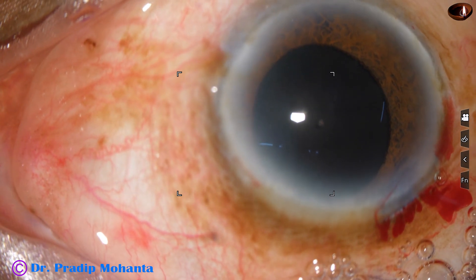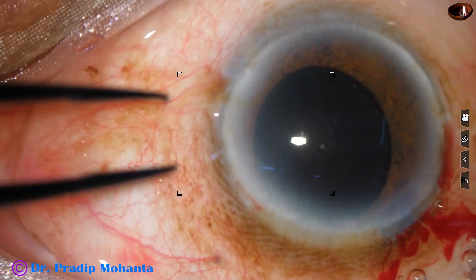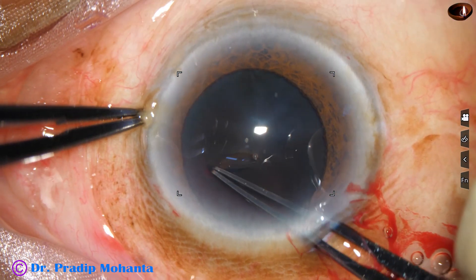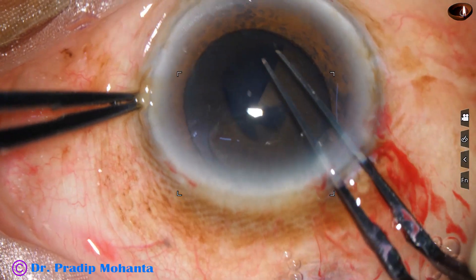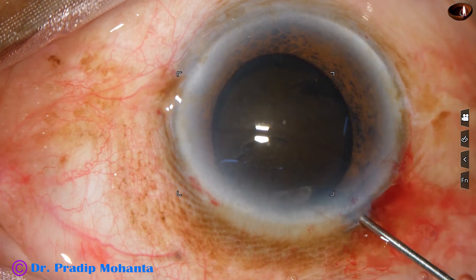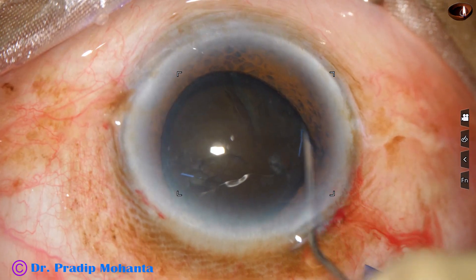And now capsulorrhexis is to be done. I take Utrata forceps, pierce the anterior capsule at the center, and raise a capsular tag. This capsular tag is guided along the border of the pupil to get an adequately sized rhexis of about 5.75 mm, almost 6 mm. Unless we do this, there will be too much zonular stress — there can be zonular dialysis and worse. So a large rhexis is the first step to manage such cases.